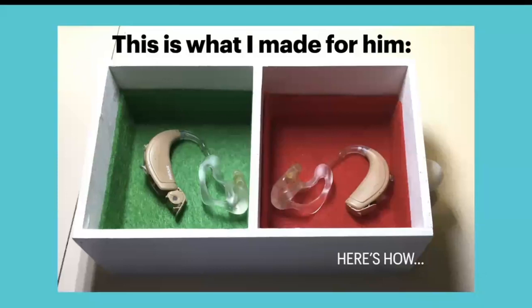This is what I made him. There's a little box with the left hearing aid in the green side and the right hearing aid in the red side. If you don't already know, the right hearing aid always has a red dot — R is for right, R is for red. That's how you can tell, except that if you're a little older and have trouble seeing, you can't see that dot anyway.